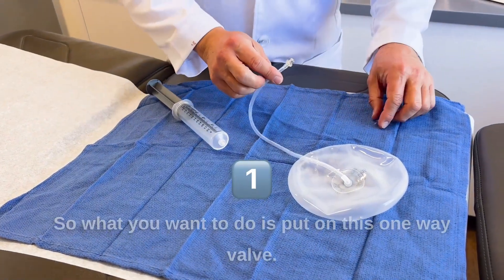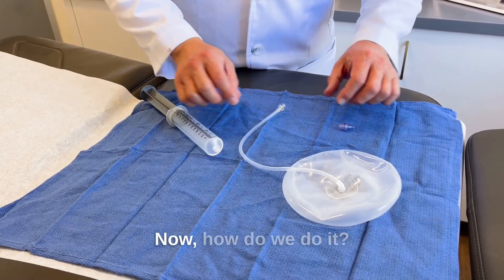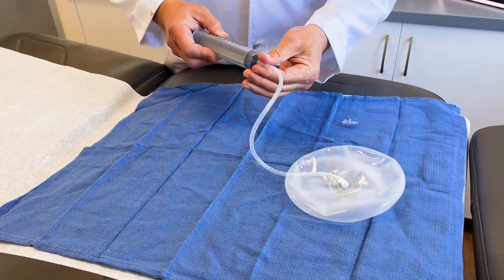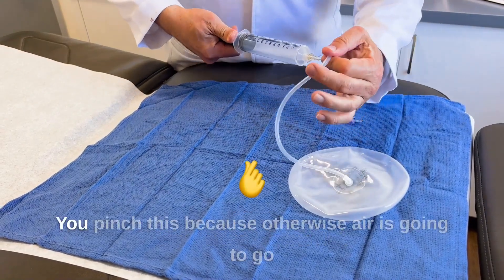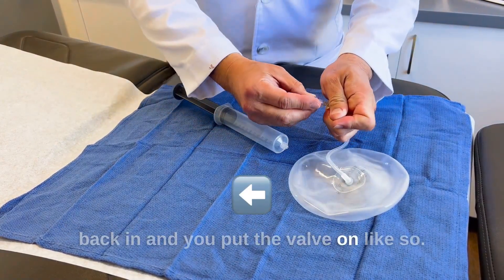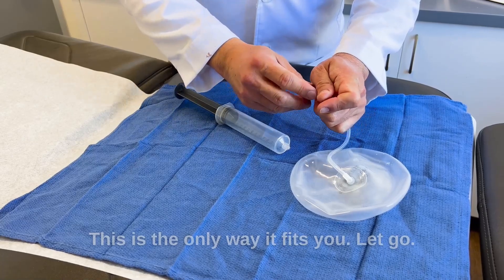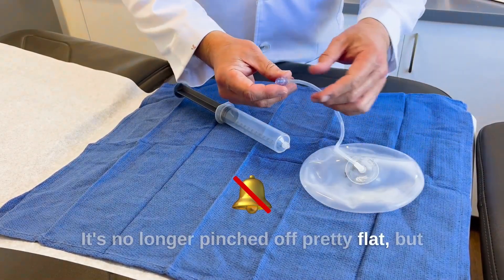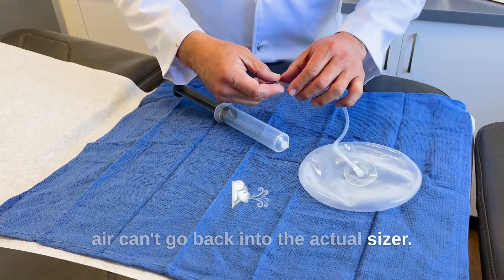So what you want to do is put on this one-way valve. How do we do it? You suck out the air — you notice it goes flat — you pinch this, because otherwise air is going to go back in, and you put the valve on like so. This is the only way it fits. You let go, it's no longer pinched off, pretty flat, but air can't go back into the actual sizer.